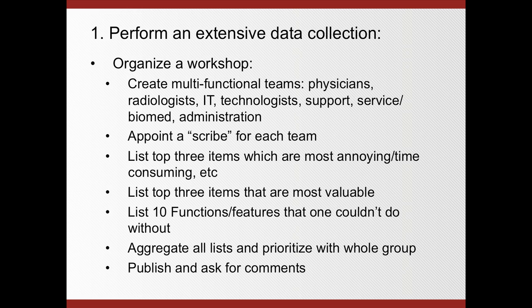Then second, you want to also look at the positive, of course. You want to look at the top 3 items that are the most valuable. That if somebody says, no, this thing is absolutely great, I could not live without it. You know, these are the most valuable. These are the top 3 things that I would buy the system for.